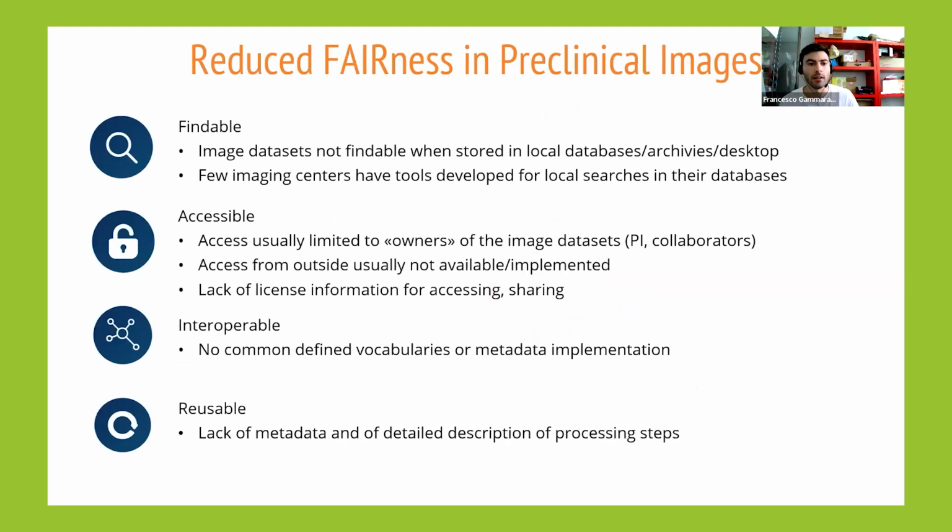At preclinical level, the images are stored in local databases or in local PCs, so they are not findable, and of course, they are not accessible from outside. And from the point of view of interoperability and reusability, information and metadata are not commonly defined. So preclinical centers can use specific vocabularies, terms, but they are not fully recognized by others in the same or in other fields.